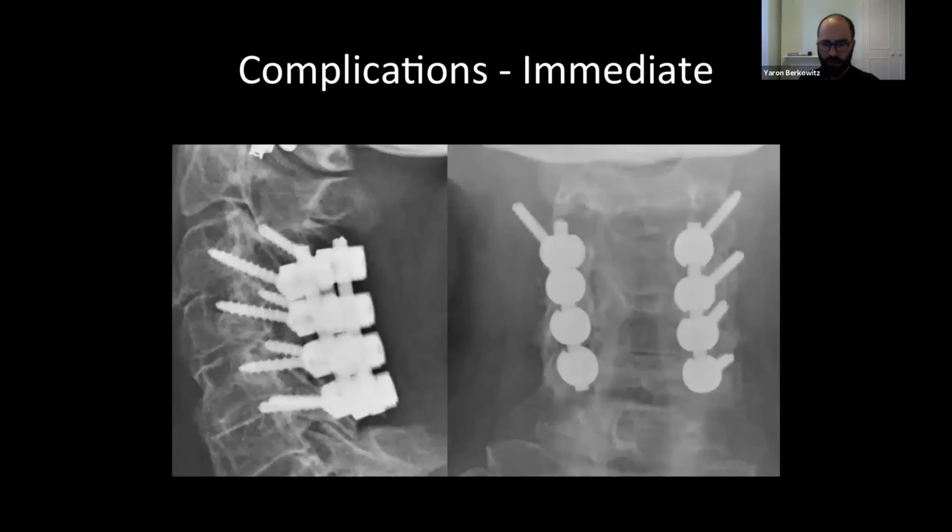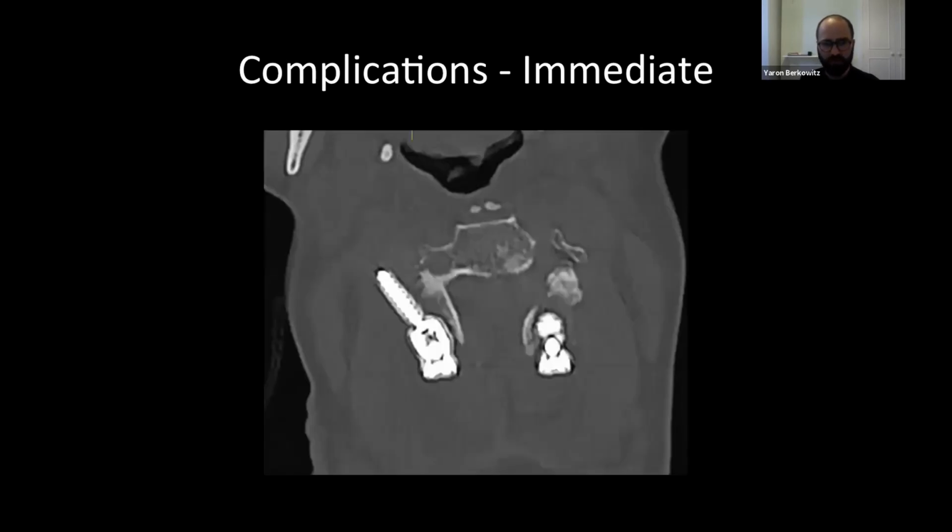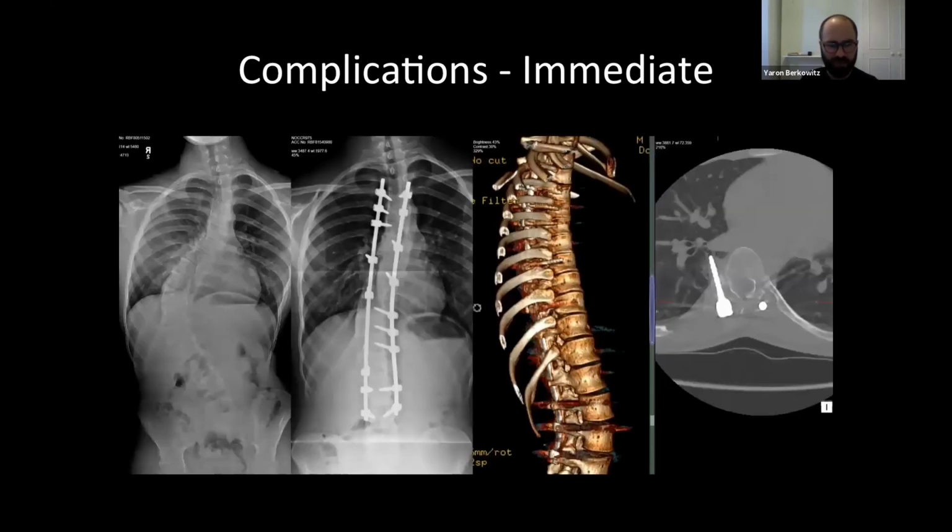So this is a patient with an immediate complication. You can see that they've had a cervical posterior fixation, and this screw is just a little bit too lateral when you look at the X-ray, if you look at the others. Cervical screws do often go in a slightly more lateral direction, because that's the direction of the pedicles. You can see that this is a laterally placed screw. Unfortunately, this patient didn't have any problems with that. But if that screw is too far lateral, it's not in bone, and that means that they could get a construct failure, which this patient actually did get, and they then had to have a revision.